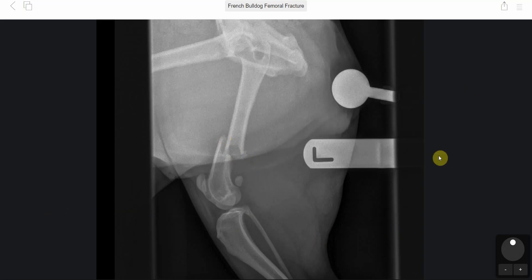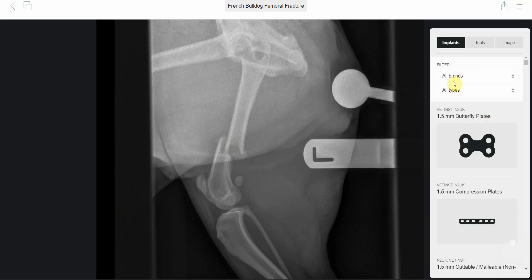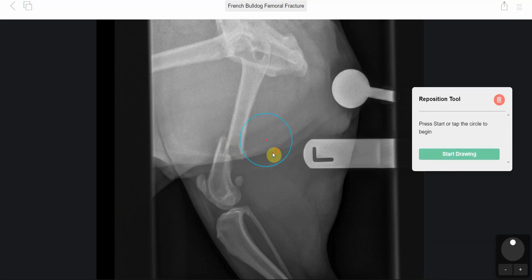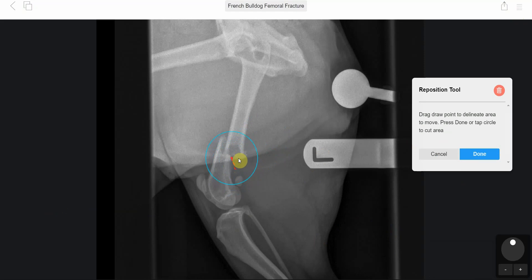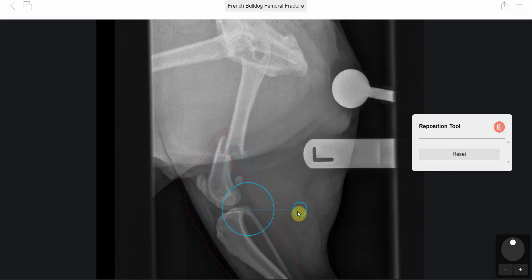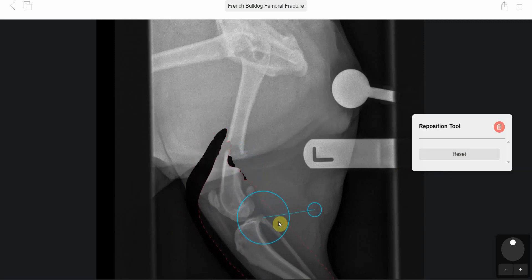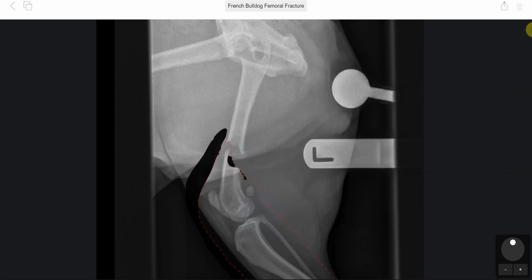What we wanted to do was look at placing a plate and a rod. In terms of assessing the fracture, we need to think about what implants would work well. Drawing around the fragment like so allows us to move it, realign it, and have a think about implants.